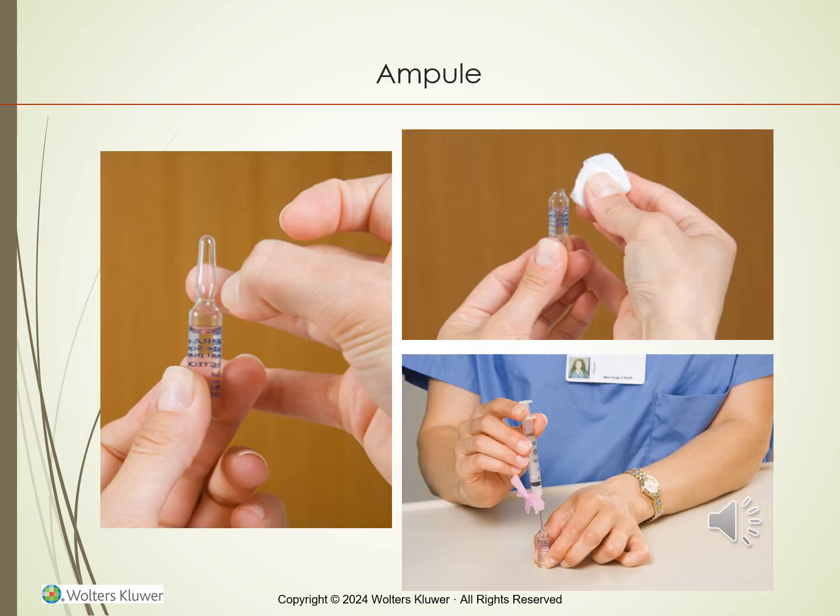This is what an ampule will look like. The medication is stored in a glass ampule, and they are single use. Before drawing up medication from an ampule, you want to make sure that there is no fluid in the top part of the ampule and all the fluid is in the bottom. You will then crack the top of it off and then insert the needle and draw up the medication.